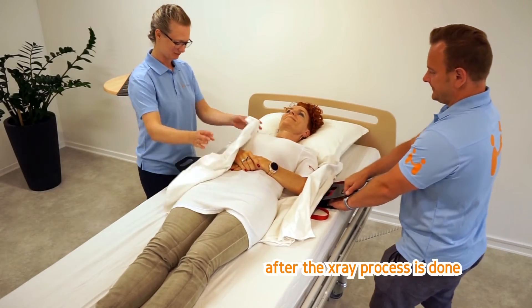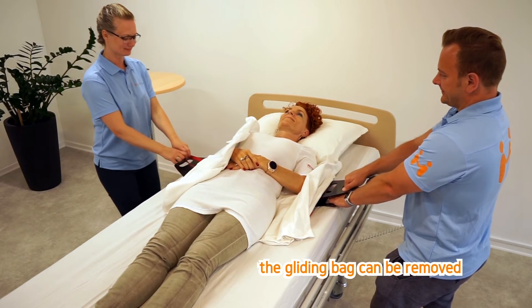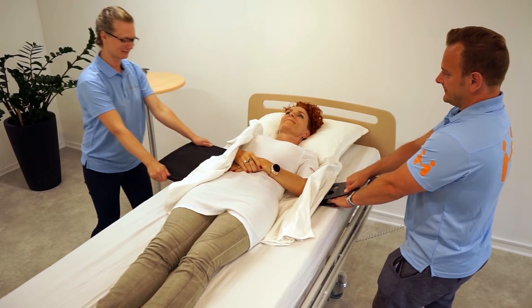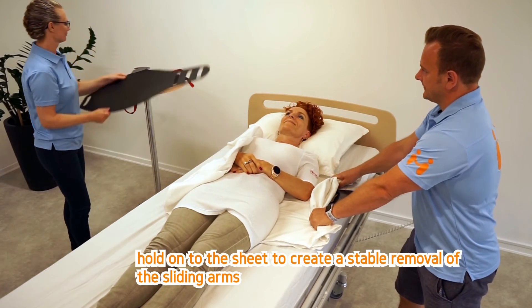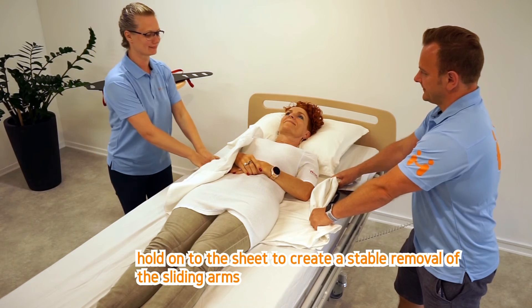After the X-ray process is done, the gliding bag can be removed. Hold onto the sheet to create a stable removal of the sliding arms.